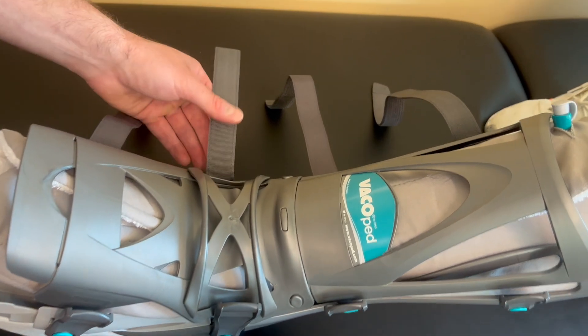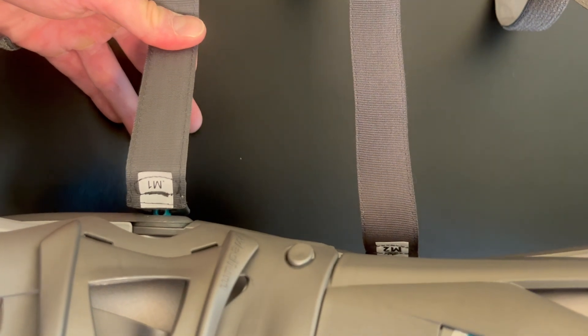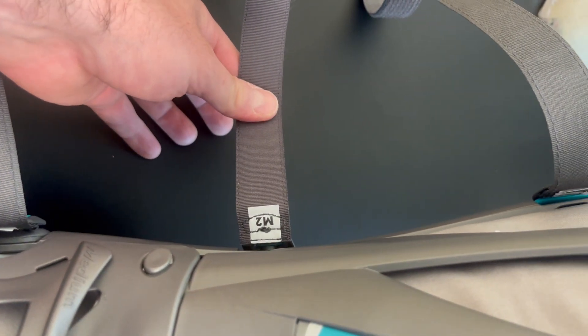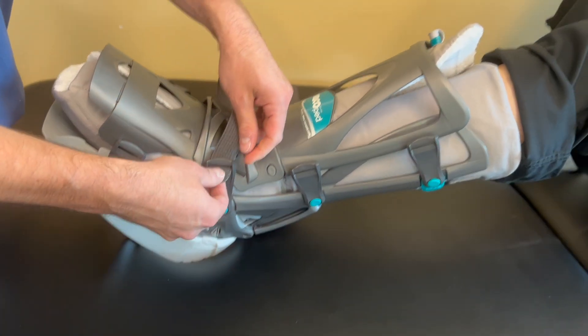Next, secure the straps to hold the front panel in place by lacing them through the buckle and over the front panel. You may notice that each strap has a number — this correlates to the order in which you fasten the straps. Straps one and two are closest to the ankle, and three and four are farther away.